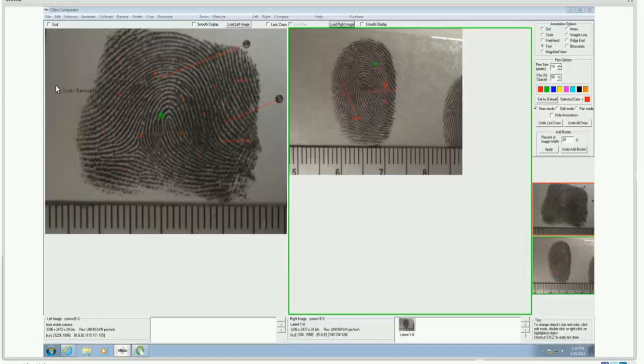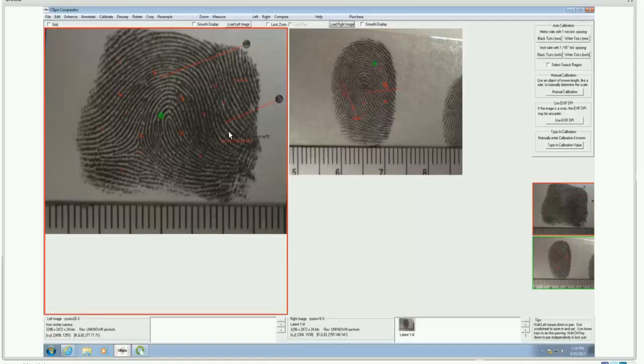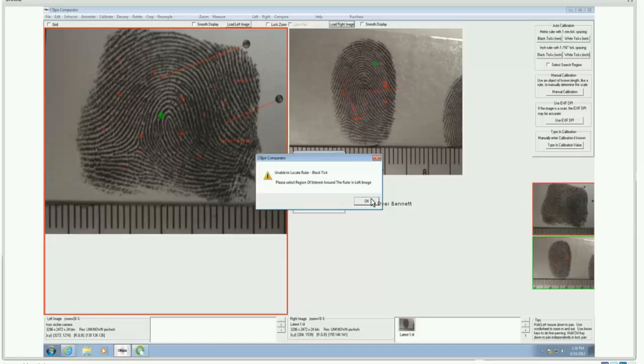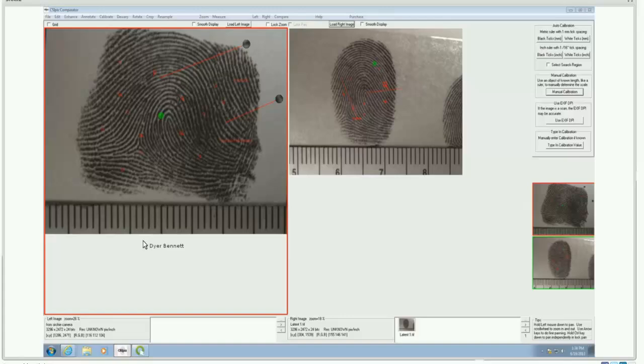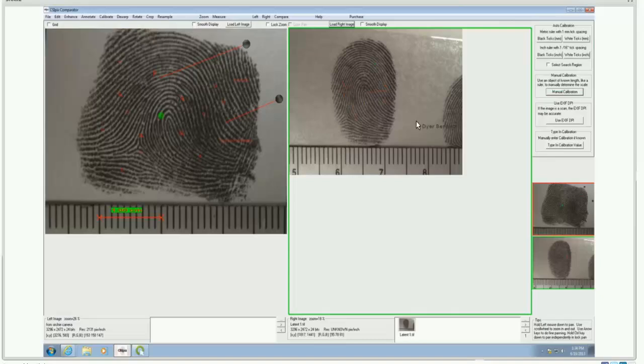Let's go through some more functions. For calibration — if you have a clear ruler in the image — you can attempt automatic calibration to confirm that one inch is one inch or one centimeter is one centimeter. If automatic calibration fails, you can default to manual calibration, where you determine the distance from tick mark to tick mark and manually type in that distance. Once calibrated in both images — for example, setting 10 millimeters — the system is now calibrated.